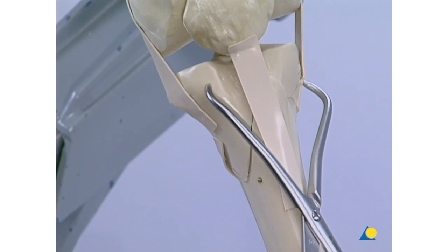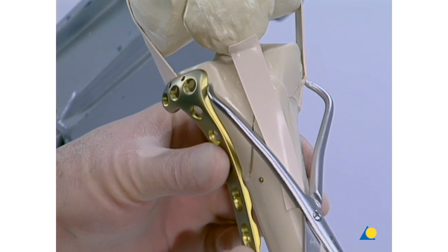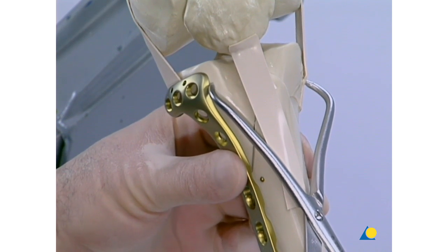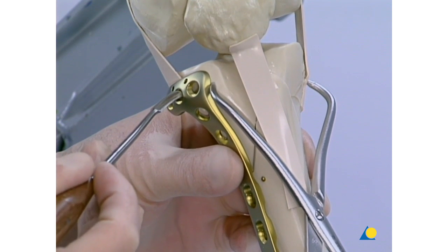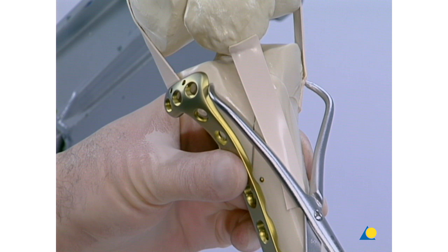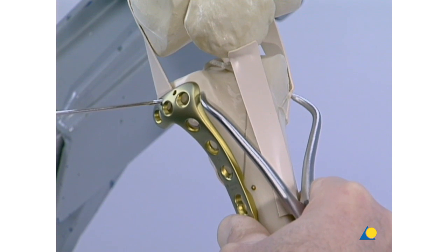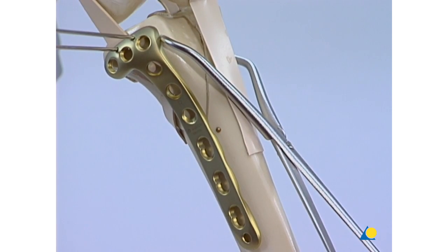A 4.5-5.0 LCP proximal tibial plate is placed to support the lateral condyle by buttressing it. Alternatively, either a T buttress plate or a tibial head buttress plate can be used. The LCP is fixed temporarily with two K wires, as shown here.